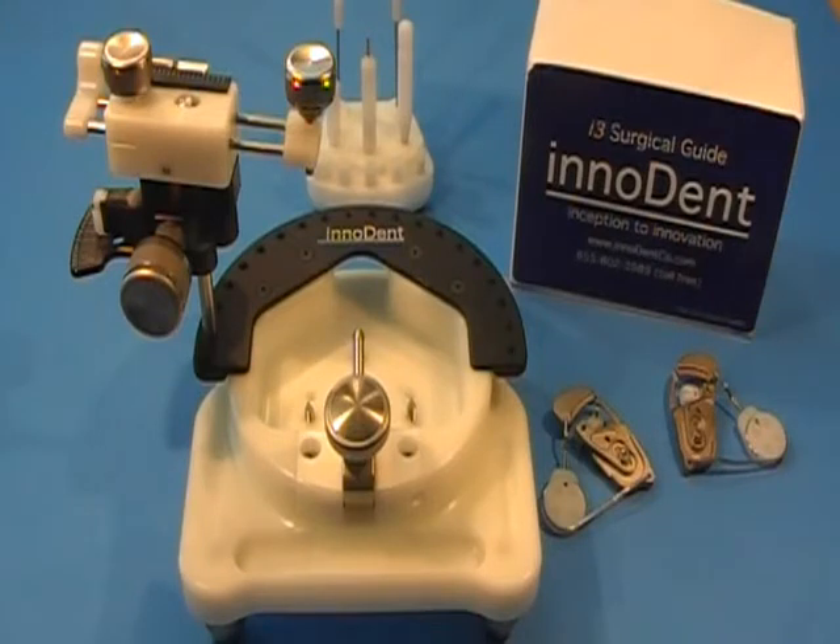In your box, you have received four surgical guides, a tool caddy, and one guide station.